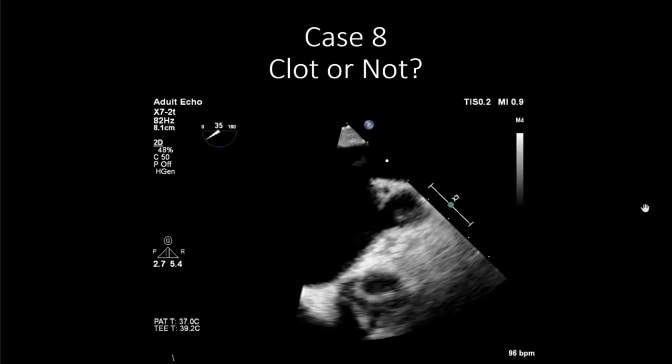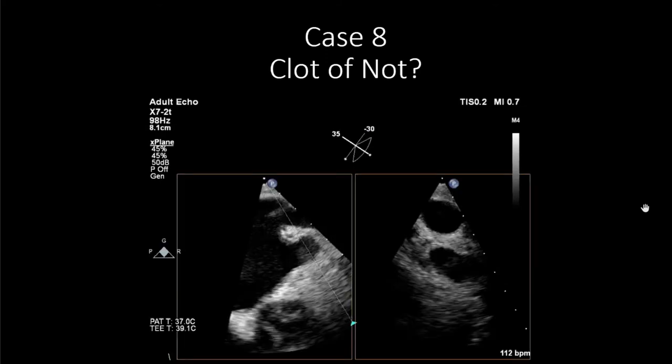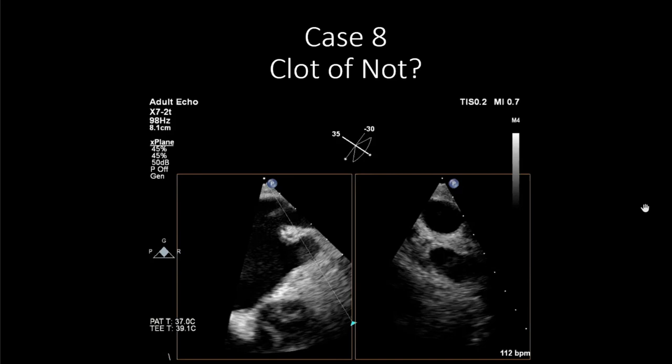This last case: we're at the ostium, a little off axis. The appendage isn't fully open, but we see something — independently mobile, kind of hazy, not fully formed, sitting very close to the front. We biplane it. The biplane shows that there might be something there, but it's not quite formed — could it still be artifact? We do a velocity. The Doppler isn't that great. That doesn't help us. Sometimes we say we can't tell, and we do a CT.